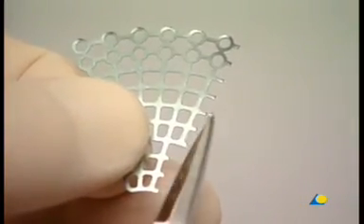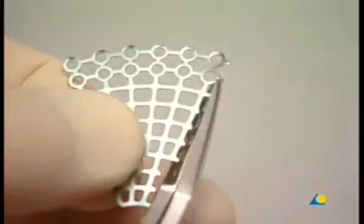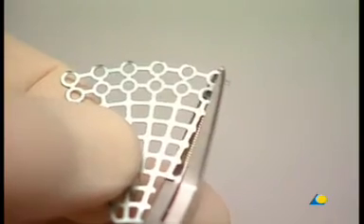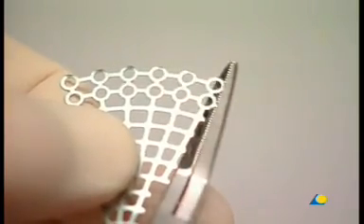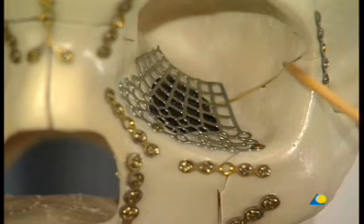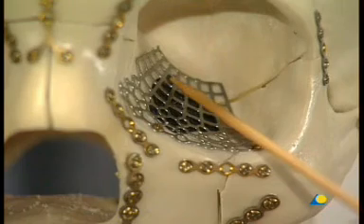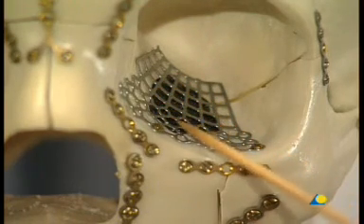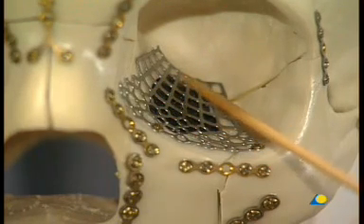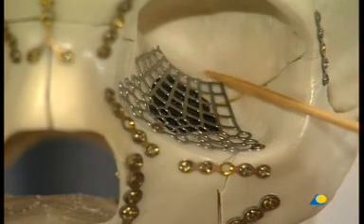All sharp edges are trimmed, and soft tissues are properly retracted to ensure that they are not trapped. It is important to use a large enough plate to span the edges of the orbit, with particular care taken to span the posterior ledge of the orbit. After the posterior ledge is spanned, the orbital mesh plate requires only minimal screw placement.